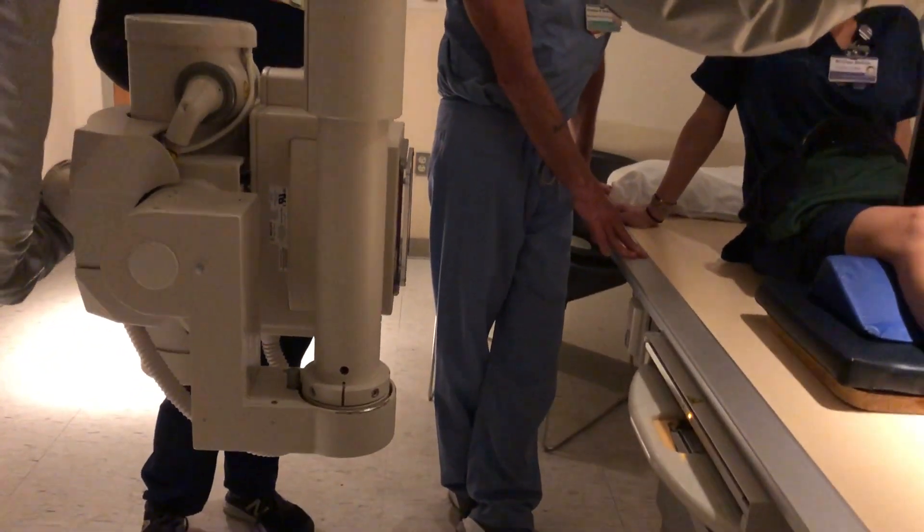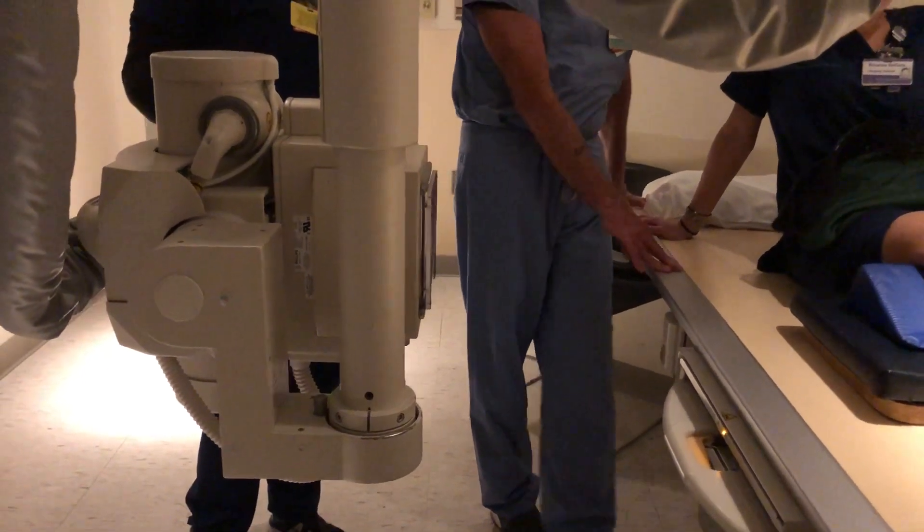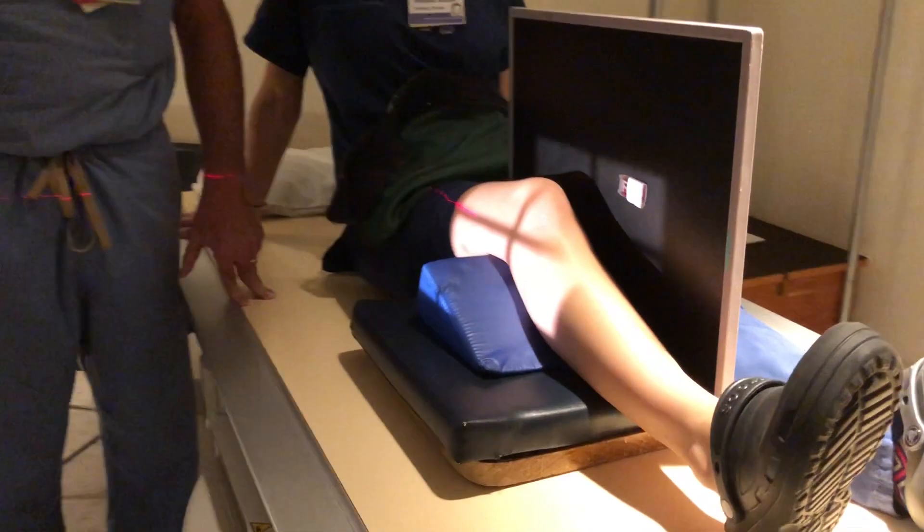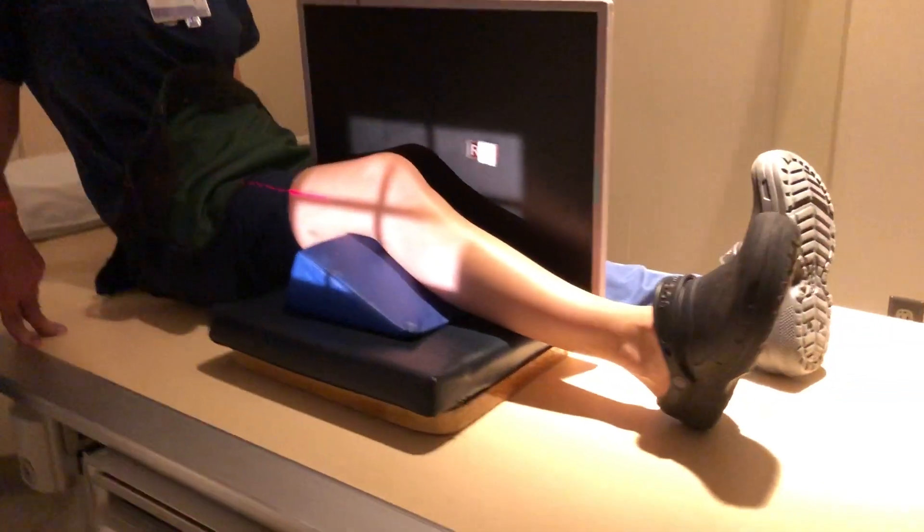We're going to do a lateral, cross-table lateral of a knee. It's a lot easier for the patient to get in this position, especially elderly patients. This is pretty much protocol in a lot of areas, especially the ER.